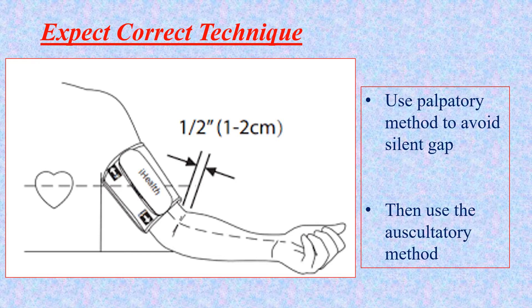Then place three fingers on the radial artery to feel the radial pulsation. Start to inflate the sphygmomanometer cuff until you no longer feel the radial pulsation. Then begin gradual deflation of the sphygmomanometer cuff gradually until you start to feel the radial pulsation again. At that point, this is the systolic blood pressure reading determined by the palpatory method. Then follow with the auscultatory method — but why must you start with the palpatory method? To avoid the auscultatory gap.